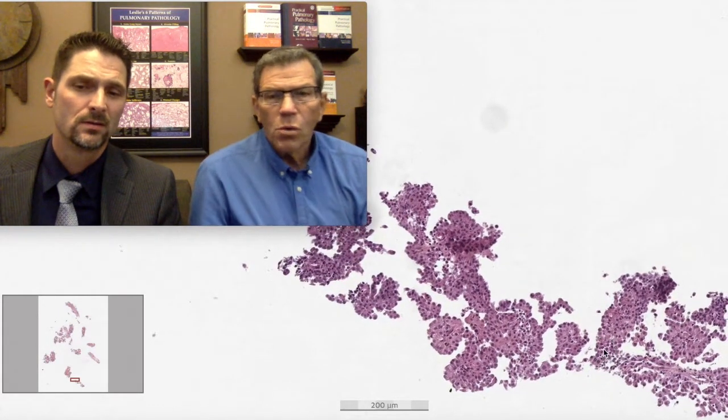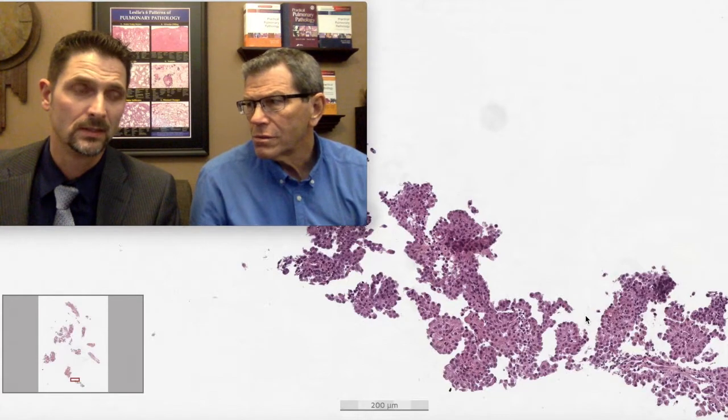Once we're at malignancy, really our only job left is to distinguish that these are mesothelial cells and not carcinomatous cells. Epithelial cells, right. So we've got to do some stains. Do you have a preferred approach?